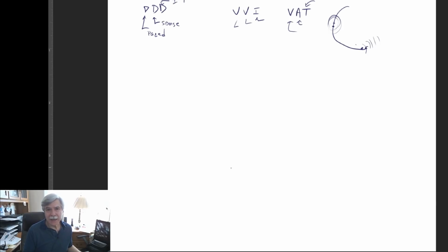So when you have a DDD pacemaker, there are 4 different types of behavior that you can notice. One is atrial pacing, and that's when the sinus node is not working properly, but the AV node is working okay. So the sinus node is no good, and the AV node is good. And so you have no atrial beats, right? Sinus node is slow, you have no P waves. So the pacemaker paces in the atrium.